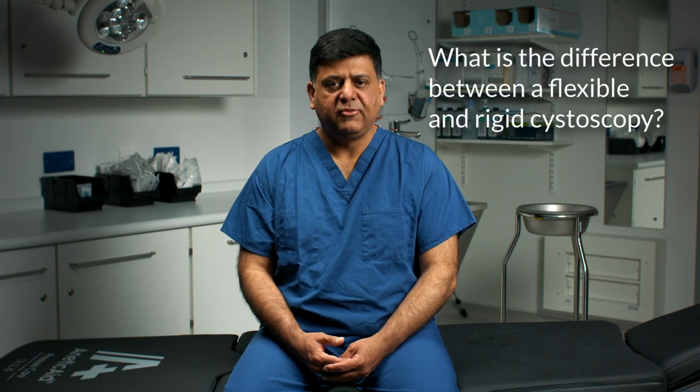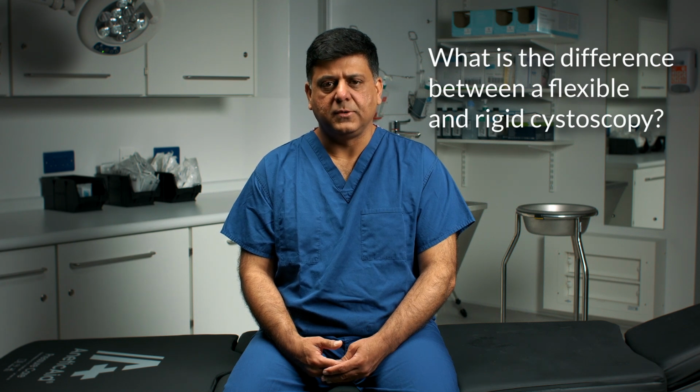What is the difference between a flexible cystoscopy and a rigid cystoscopy? There are two main types of cystoscopies, which are a flexible cystoscopy and a rigid cystoscopy. The main difference between the two is how they are performed. A flexible cystoscopy can be performed in an outpatient setting using a local anesthetic whilst you are awake using a fine flexible scope, whilst a rigid cystoscopy is performed in an operating theatre usually under a short general or spinal anesthetic. The most common indication for a flexible cystoscopy is diagnostic, whilst a rigid cystoscopy allows various therapeutic procedures such as removal of bladder tumors or treating bladder stones.